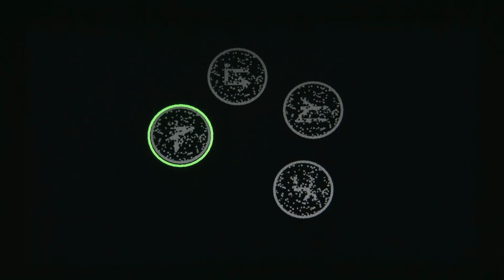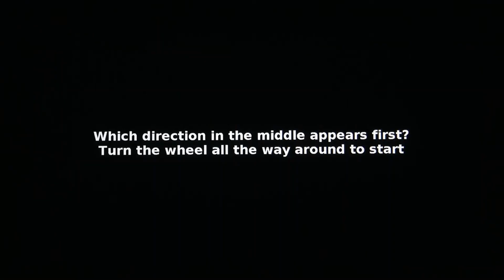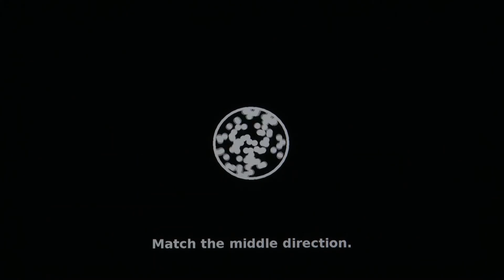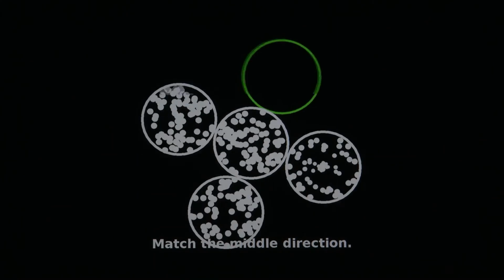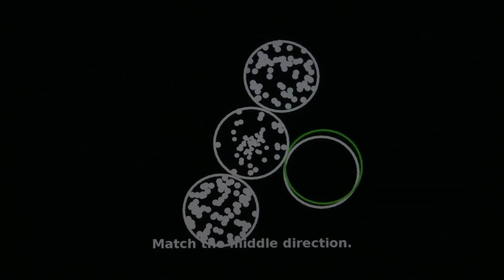The patient is tasked with remembering a motion pattern and then finding it among other motion patterns. Cognivue uses 3 types of motion patterns: planar motion, which is left, right, up, or down; circular motion, which is clockwise or counterclockwise; and radial motion, which is motion from or to a focal point.